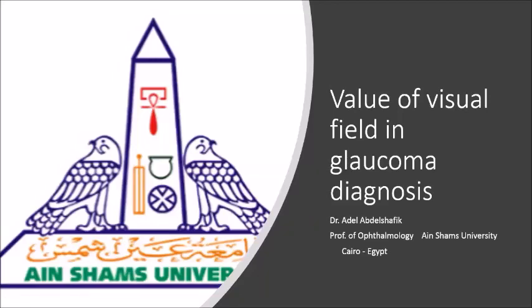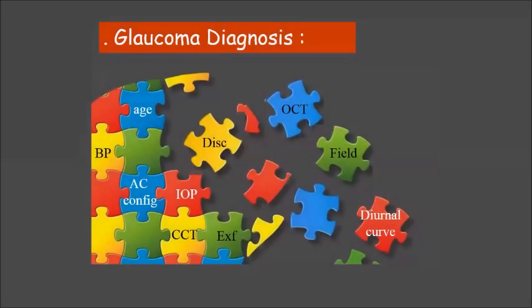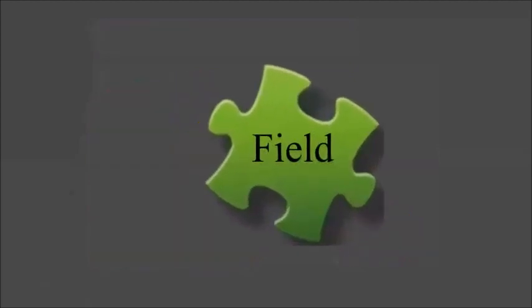The title is Visual Field in Glaucoma Diagnosis. As you know, diagnosis of glaucoma depends on so many factors. Today, I'm going to rely only on the field.